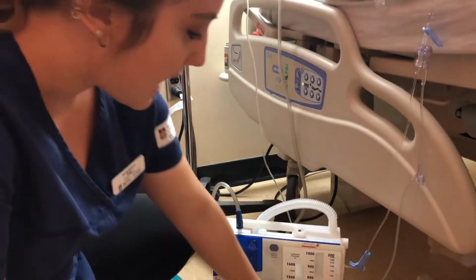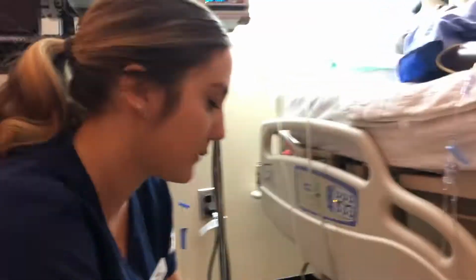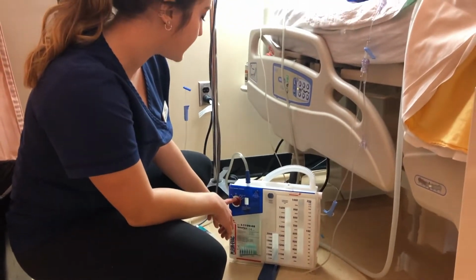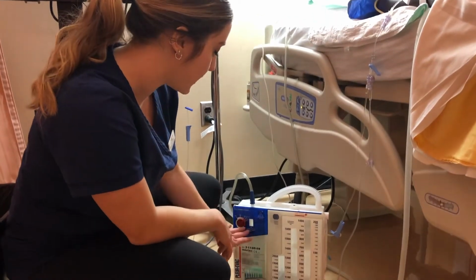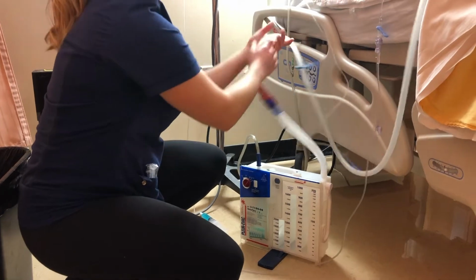I'm noting how much drainage there is, the characteristics of the drainage, and I would mark where it is at the beginning of my shift and assess it regularly throughout. I'm also noting what the suction control is at right now, so it's ordered to be at 20 centimeters of H2O, and that's where it is. I'm also making sure that my tubes are going to my patient and to suction.